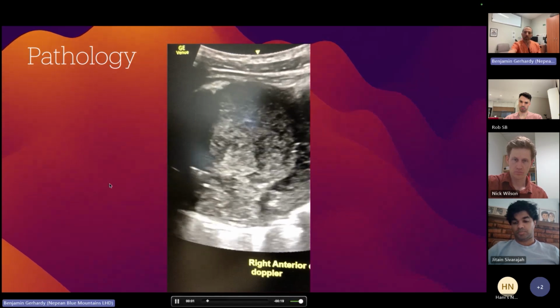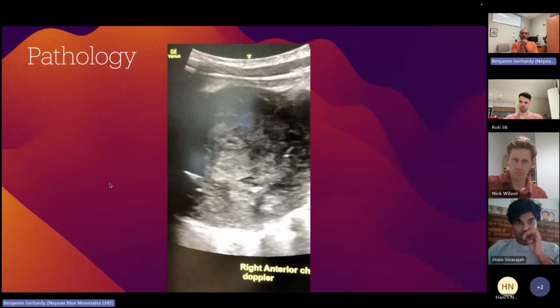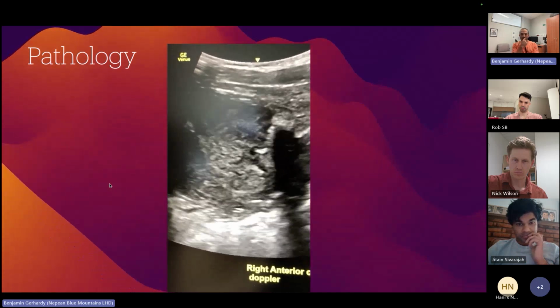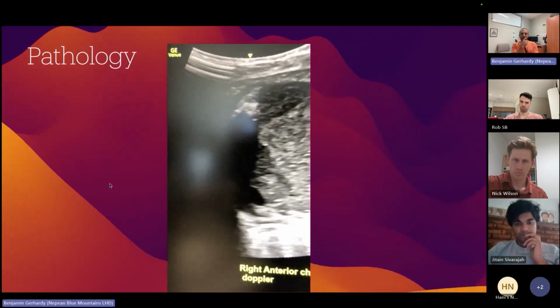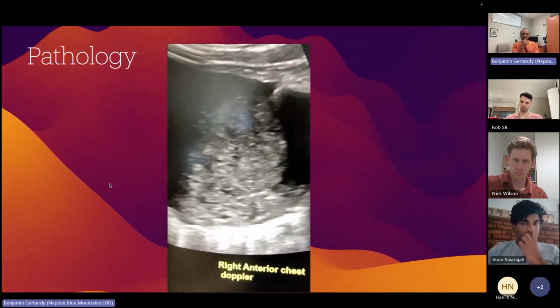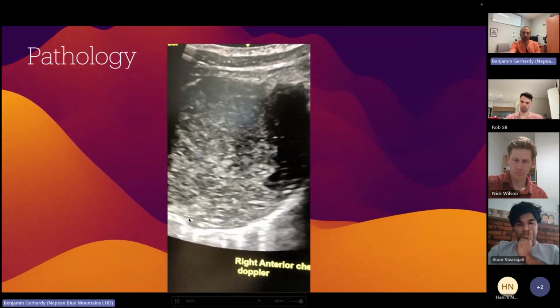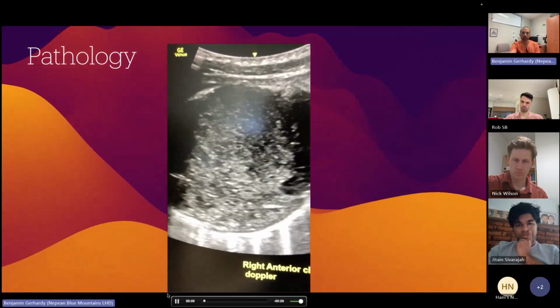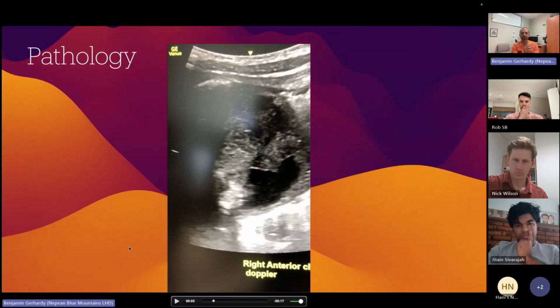Scroll back towards your chest. You can see it going that way, back towards your midline. Get towards your arm, it goes down that way. And if I go up, just on the edge of your clavicle is there, going down. So this is the young woman that presented years ago now when I was working.